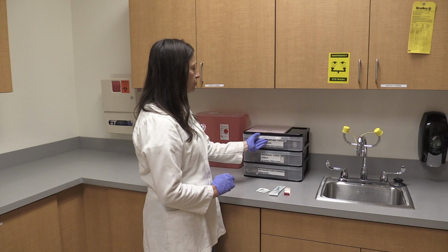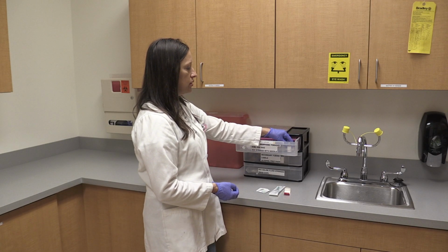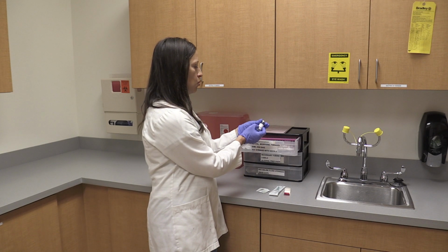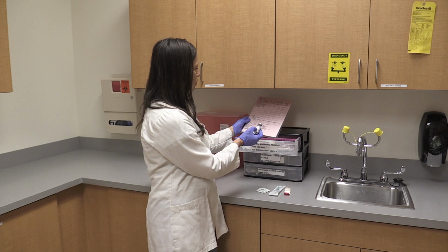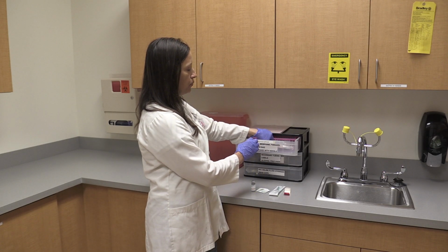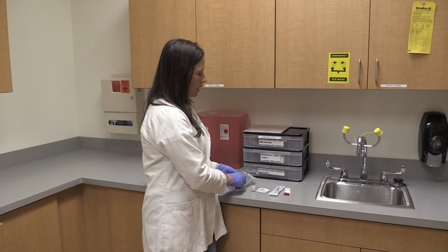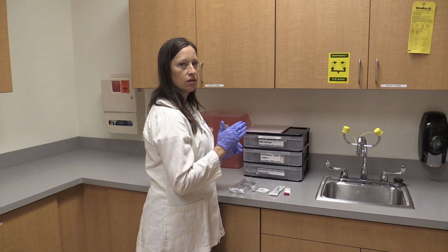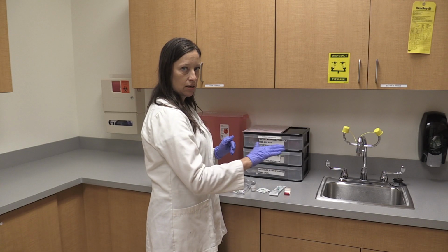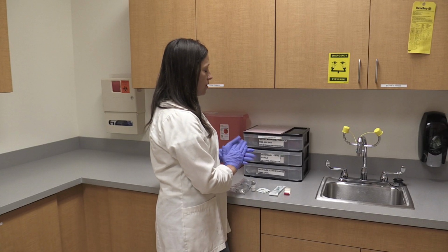So I'm going to open the Omnicell and get the medication out. This is the first check. This is called pull. So I'm going to pull the medicine out. Morphine, 4 milligrams per ml. That's my concentration that I have. I also need to pull out 2 saline flushes, because this is a saline lock. I need to flush the line first, give the medicine, and then flush the line again to get all the medicine into the patient's system. So that was my pull.